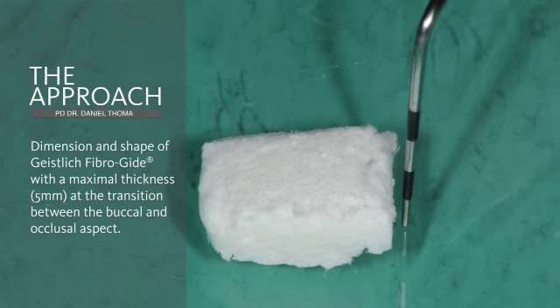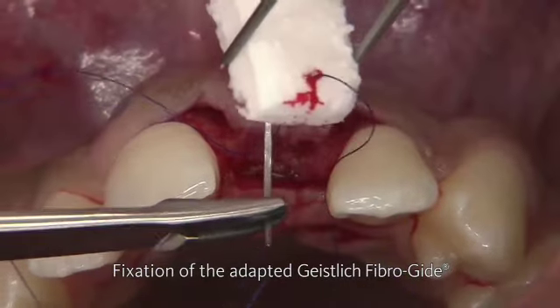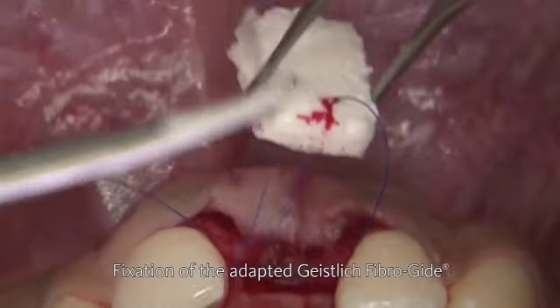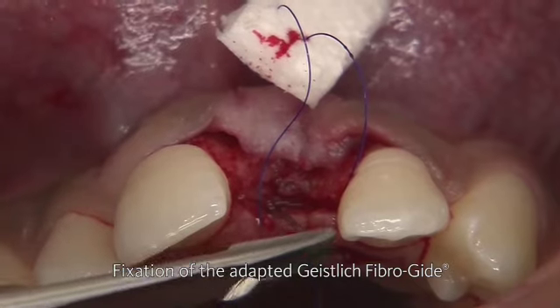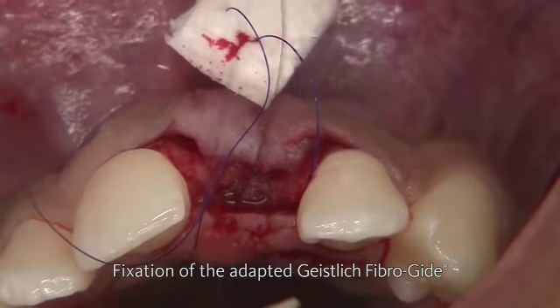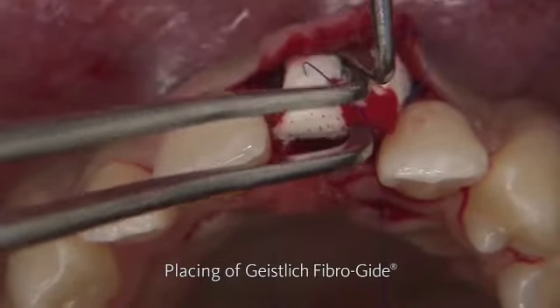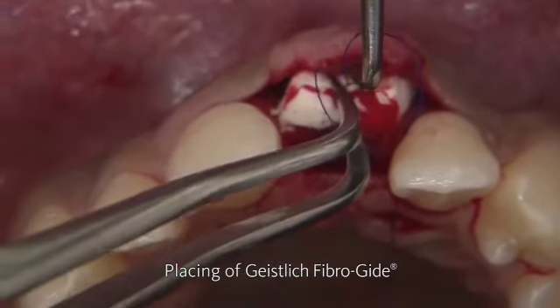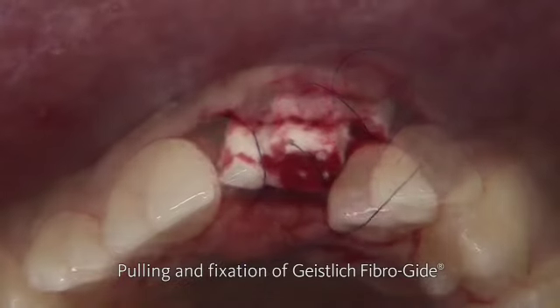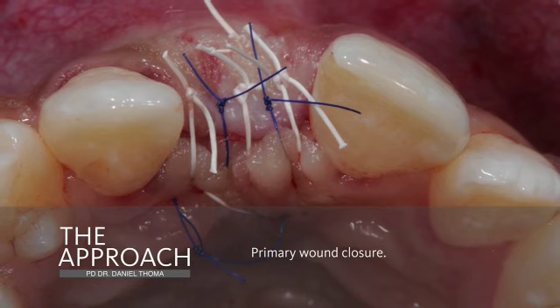Subsequently, the fibroguide is shaped to match the desired defect site, and thereafter the fibroguide is being sutured using a horizontal mattress suture towards the palatal aspect. The entire matrix is subsequently placed on the buccal side, inserting it into the pouch. Following the placement, the initial suturing with a horizontal mattress suture towards the palatal aspect, primary wound closure is obtained.